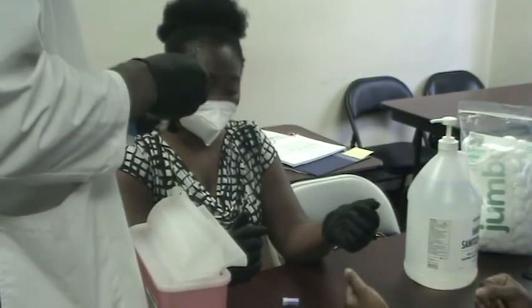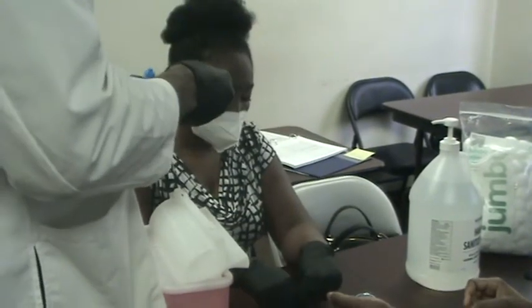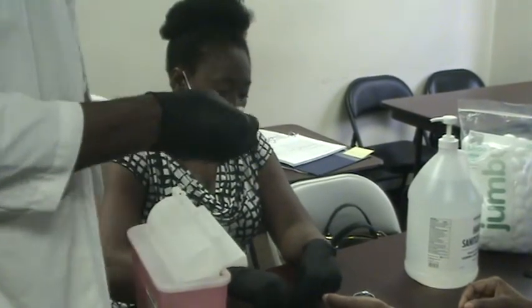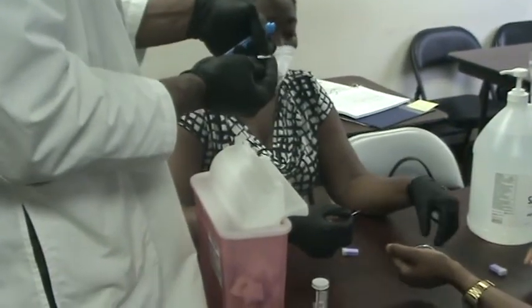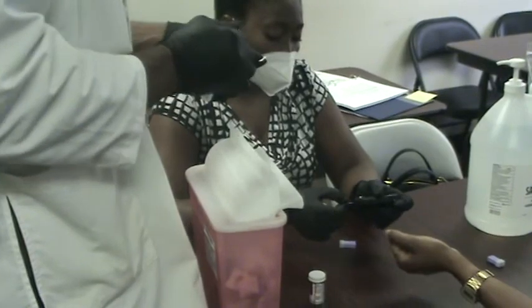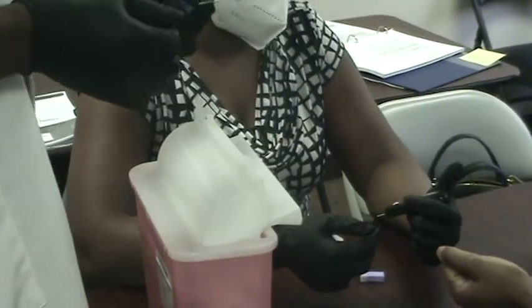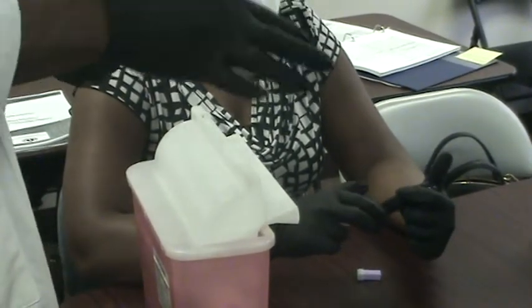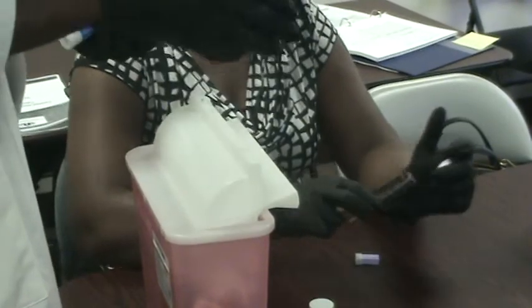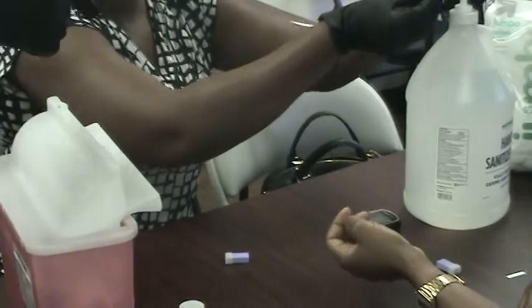So one thing with the strip, this will be one you're going to use for now. The strip has two ends. One end goes into the machine. The chip end goes into the machine. The other end collects the blood. So when you insert this, like she did, it turns the machine on. Then once it starts flashing the blood, it's ready to receive blood. You put it down, wipe the finger, get the little bit.